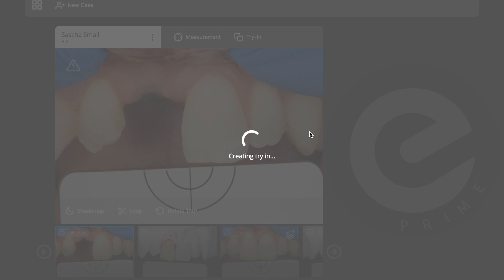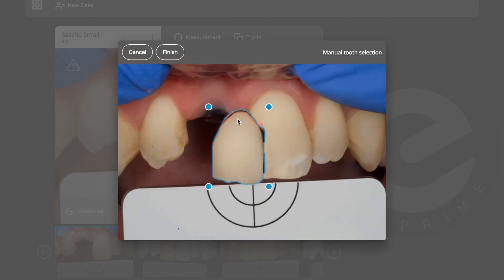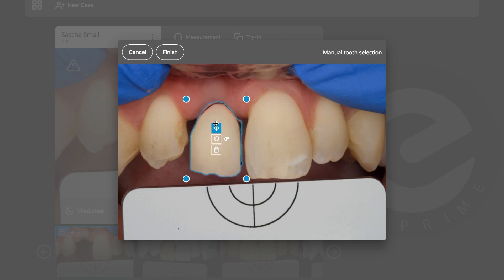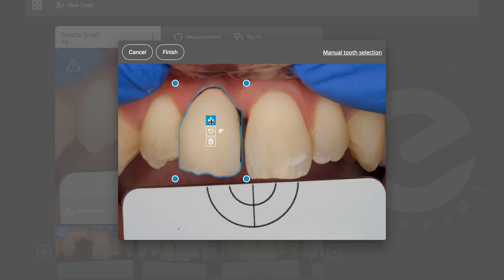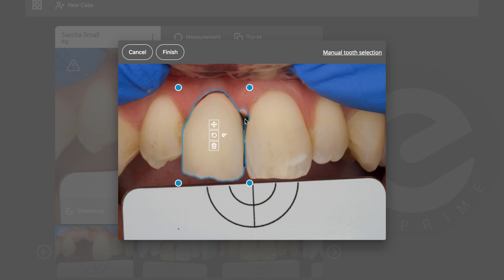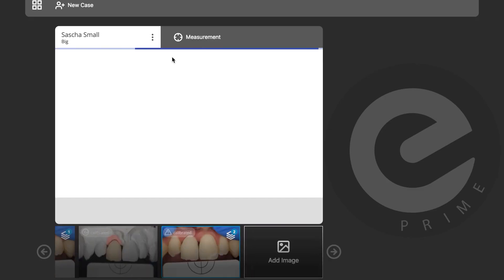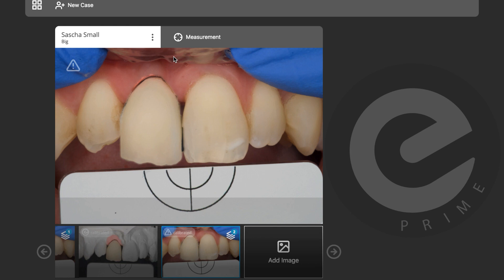I'll select this picture and create a digital try-in — very easy again. I'll take the tooth, make it a bit bigger, adjust and rotate it. Now I can see the difference in measurement. Even with your eyes you can see this area is much more similar to the natural tooth, and this area is much more similar as well. I'm completely happy now.